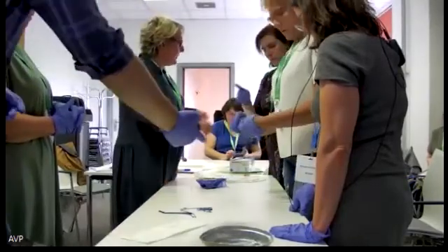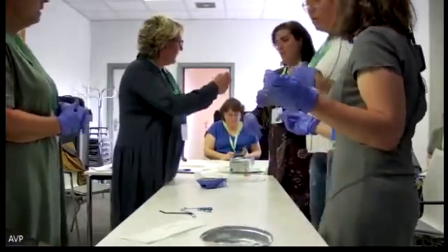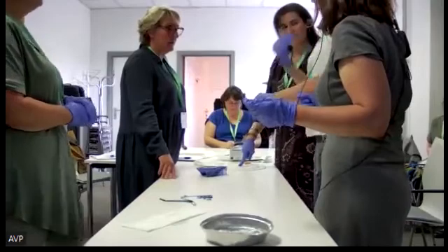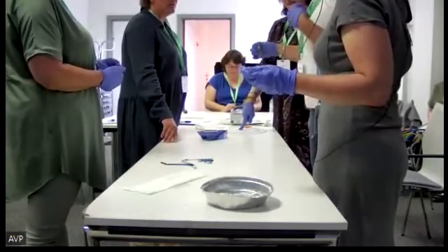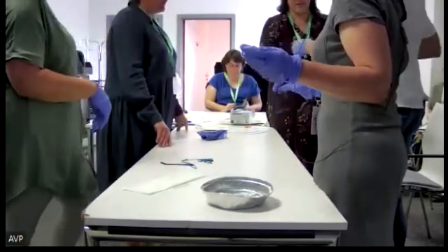Actually, you will turn it. It's for the same reason. If we have two nurses, if I want to use the torque here, and my assistant has a loop here, I can't do it. So always when you use the torque, the end has to be open.